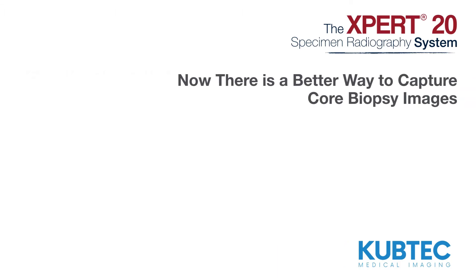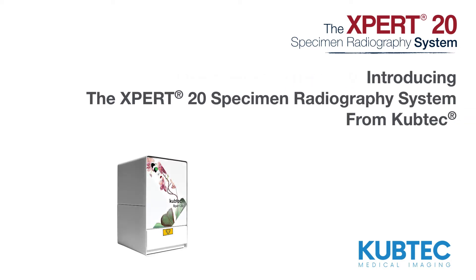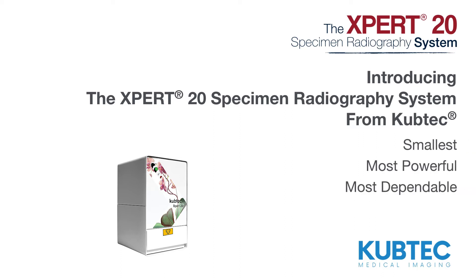Now there is a better way to capture core biopsy images. Introducing the XPERT 20 Specimen Radiography System from Kubtec — the smallest, most powerful, most dependable imaging system for core biopsies.